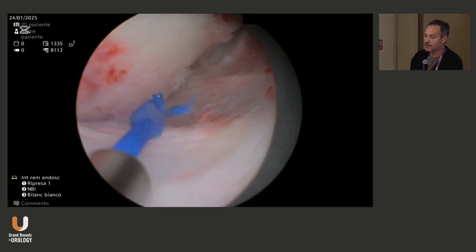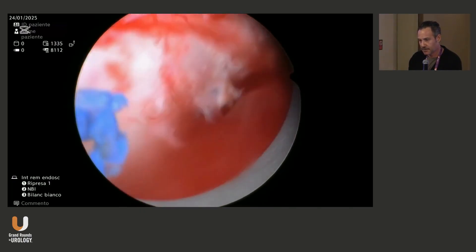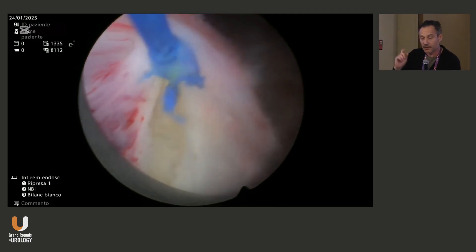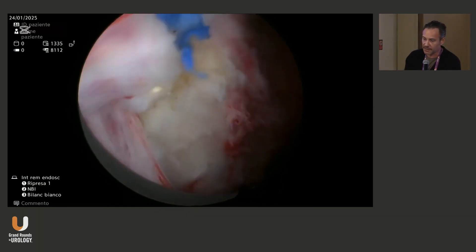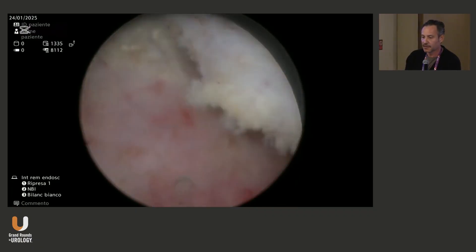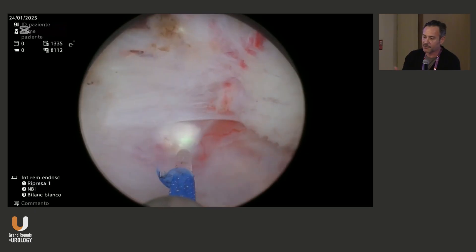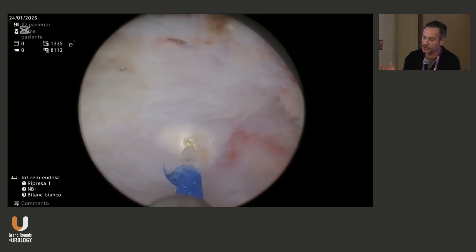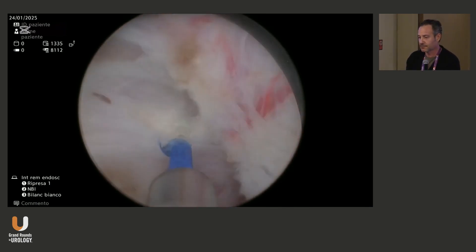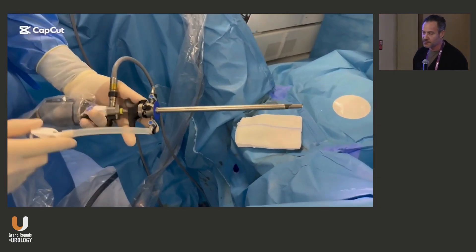Gentle use of the fiber again to find the right plane. We rotate the resectoscope and cut the mucosa for a quick release before doing anything else. Again, gentle traction with the instrument, going to the base of the gland. Here is an example of coagulation — very easy. If still bleeding, you go back; sometimes you have to follow the vessel until it stops bleeding. We are on the bladder neck of the right lobe — and this is about a 15-minute procedure. Then morcellation.